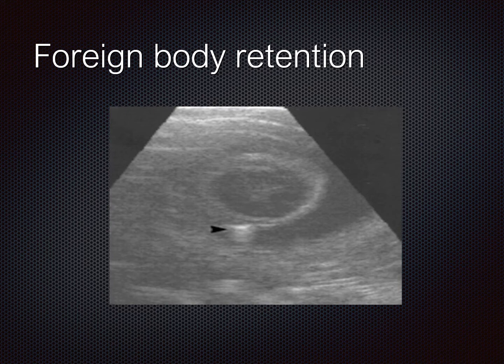And we don't want to ultrasound ruptured globes because, number one, it's a very high risk of infection, and you don't want to be the reason this person got endophthalmitis if they didn't already have it. Number two, we don't have a replacement for aqueous and vitreous humor, and so any pressure that you put on the eye while there's a hole in it is going to remove some of that fluid, and that's not great.